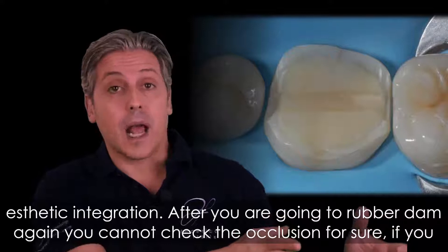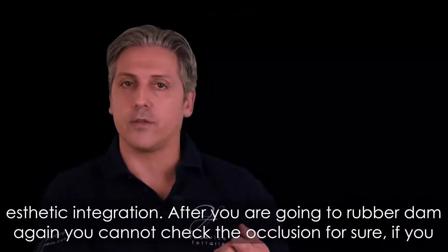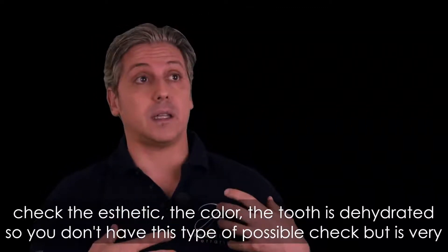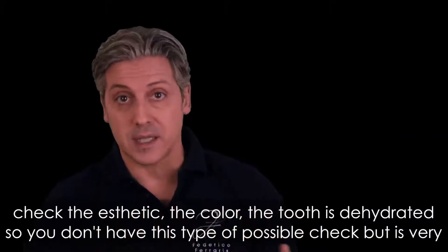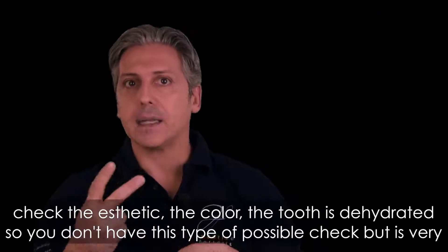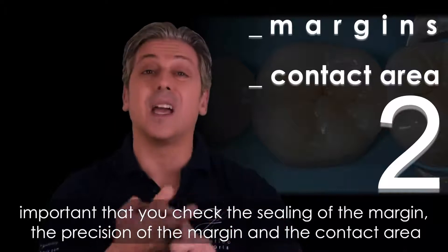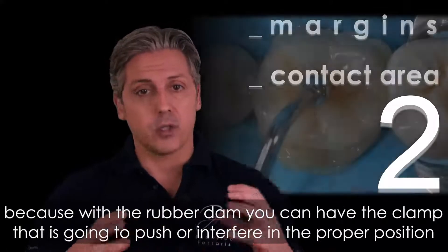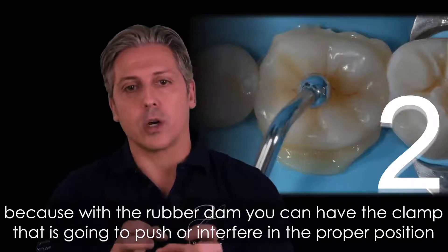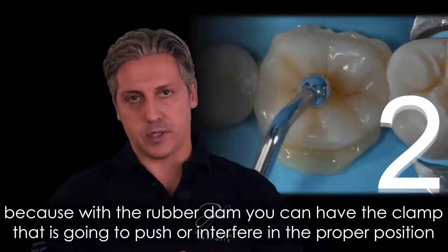After placing the rubber dam, you cannot check occlusion. If you check the aesthetics and color, the tooth is dehydrated, so that type of check is not possible either. But it is very important that you check the sealing of the margin and the precision of the margin at the contact area, because the rubber dam clamp can push or interfere with the proper positioning of your restoration.